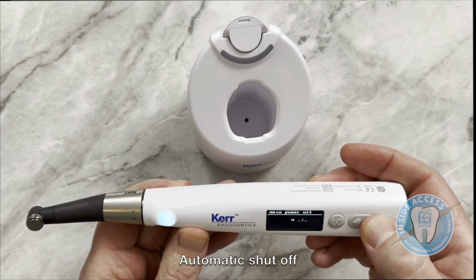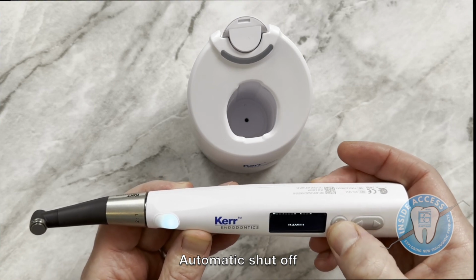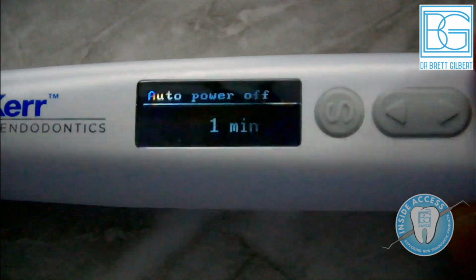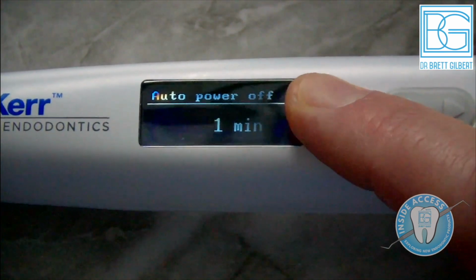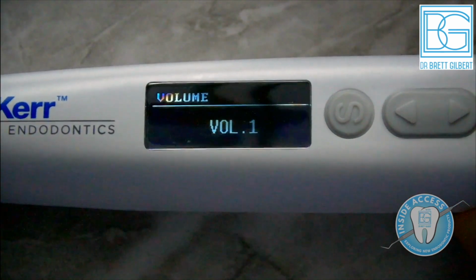And then the auto power off at 5 minutes, 6 minutes, 7 minutes, 8, and you can see it goes all the way up to 10, and I believe it goes down to 2. So whatever works best for you in your practice, even 1 minute actually, will work best, and that way it'll turn off and you can conserve the battery power. So these are the power and the actual settings that you can use initially just to make sure that you're comfortable with the unit getting started.